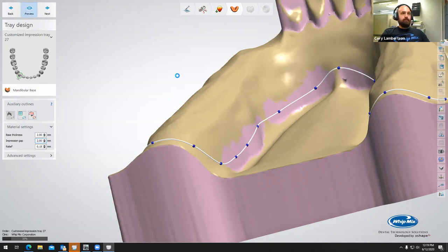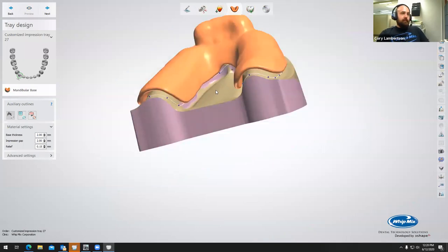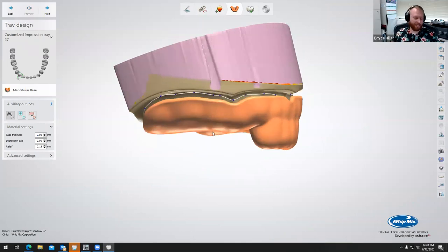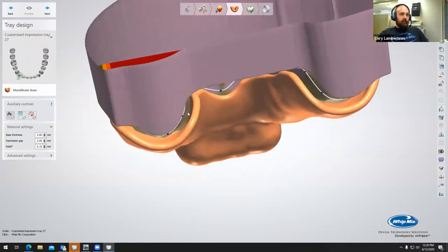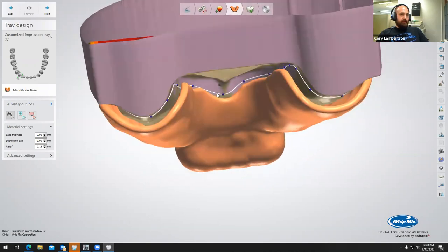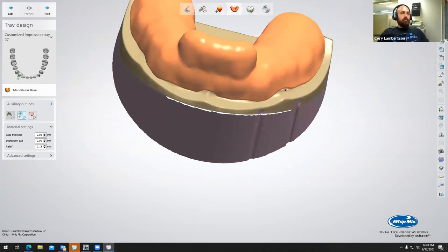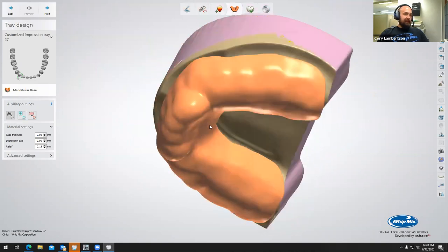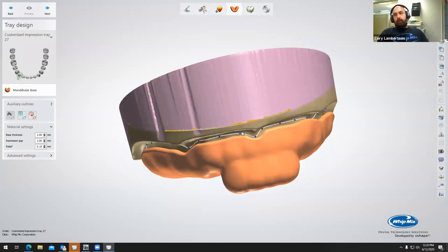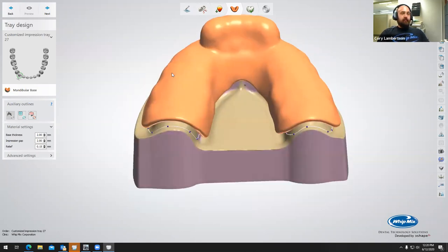We're going to go ahead and select preview. So now we can see we have our custom impression tray created for the most part, and we can see there is a relief or a gap between the actual model and the impression tray. On the left-hand side there's a window option — we can draw in a window, which creates a hole or an area where the impression tray would not be fabricated. I have seen people use this module for creating crown lengthening guides as well. This looks good — this is exactly what I want to see. We'll select next.